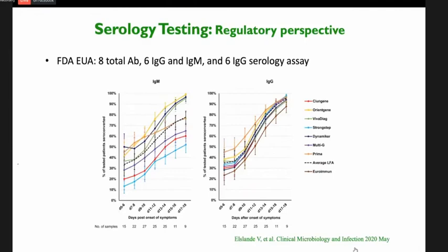There are very few reports that compare various serological assays. This one from Belgium, published last week, compared 8 different antibody tests. The study results show that these assays were somewhat agreeable with each other, particularly for the IgG subtype.